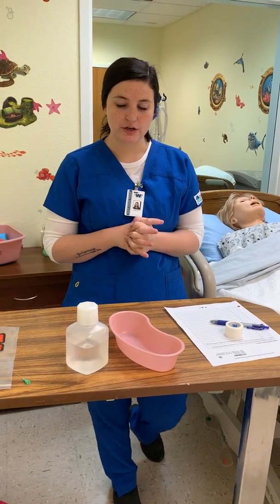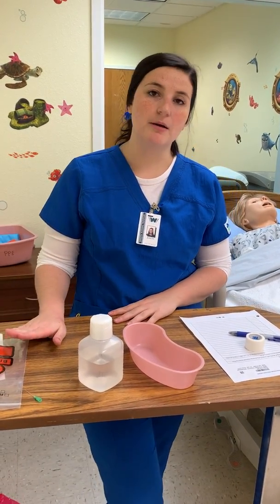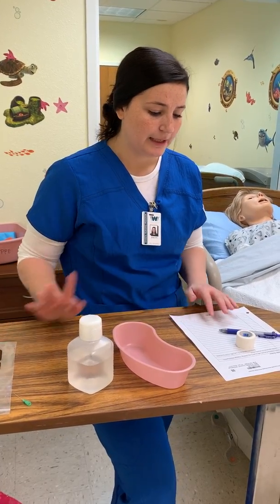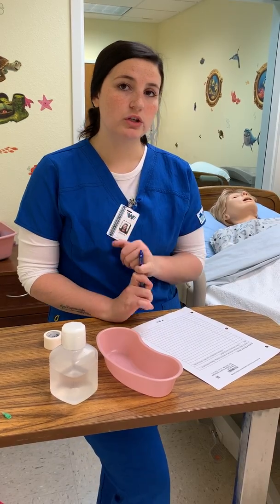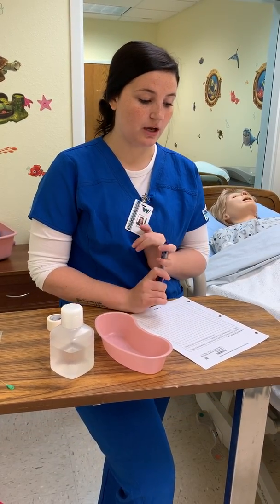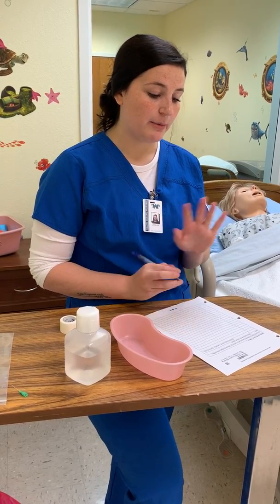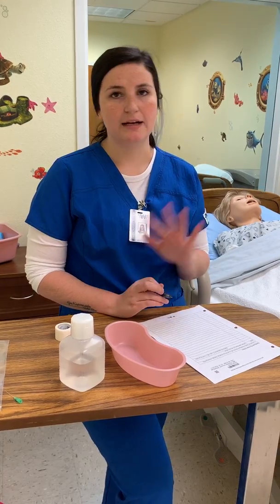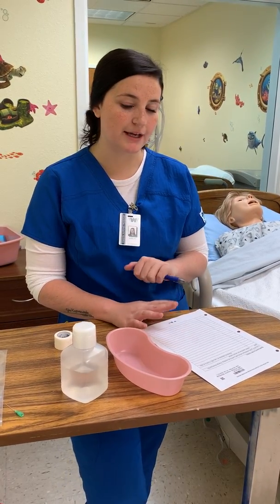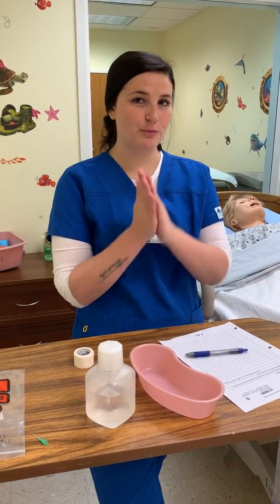leave with any of my materials, make sure everything gets in biohazard, making sure that my specimen did make it to the lab. And then I'm just going to go ahead and document what the wound looked like, that the irrigation went well, I obtained that culture and it was sent off, how my client tolerated the process, making sure to say that I didn't see any slough, there was no eschar on my client's wound, and she's now feeling good. Then I would leave the room and perform hand hygiene.